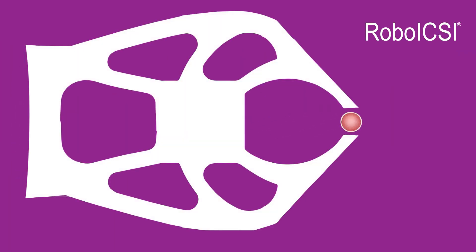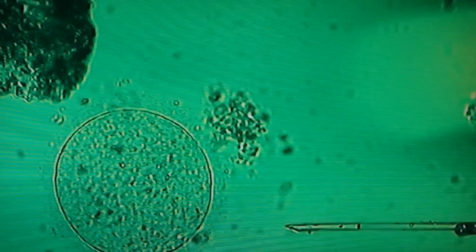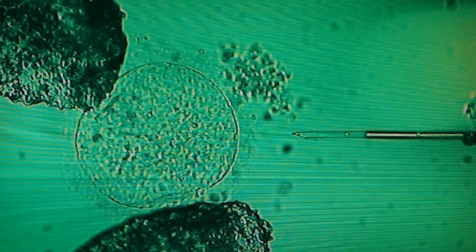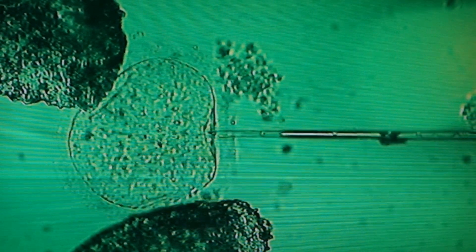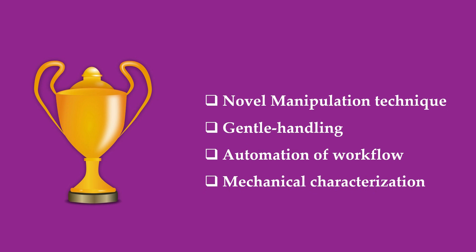Robo-ICSI does the same to the oocyte. Robo-ICSI offers a novel way of immobilizing an oocyte. It has finger-like features to grip the oocyte and hold it in place while sperm is injected into it. It is a patent-pending technology that offers many features for the first time.